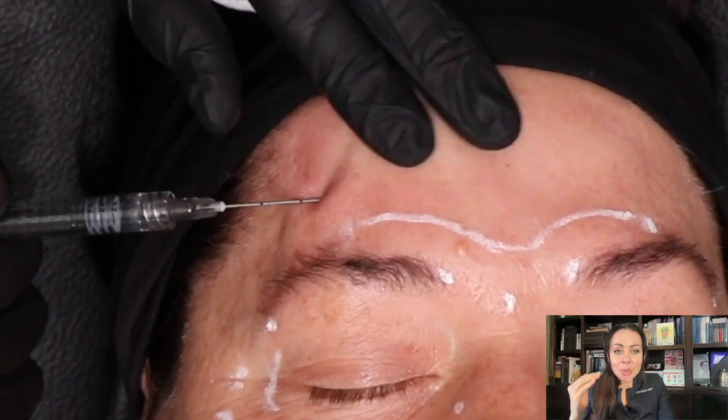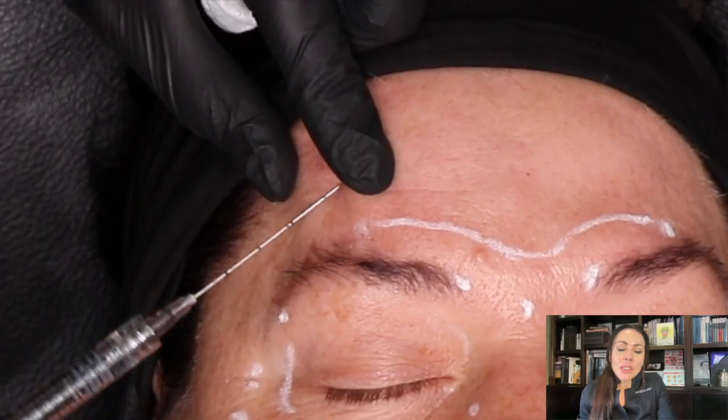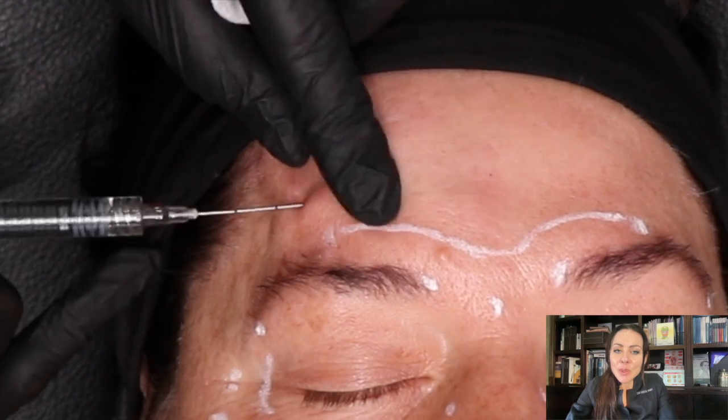While the cannula is still in, ask the patient to lift the brow so you can see which area still needs treatment. It's quite remarkable to see the result halfway through, comparing the treated side to the untreated side.